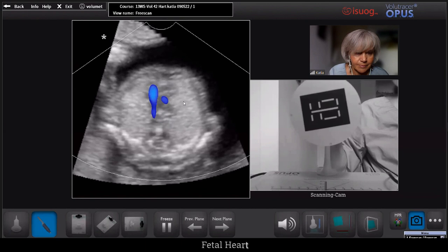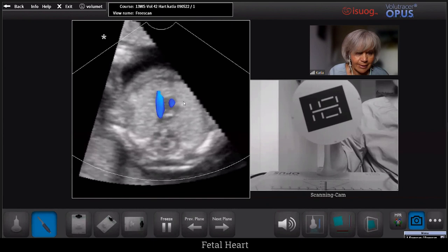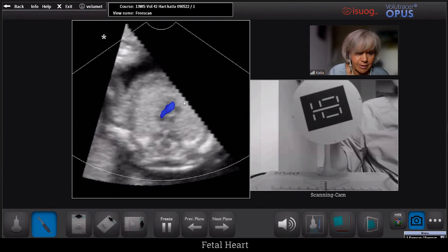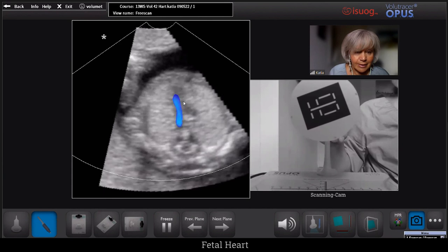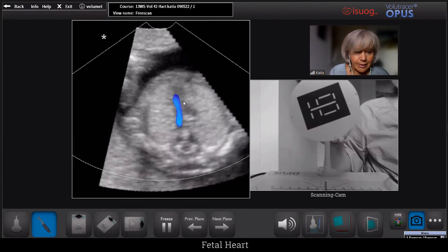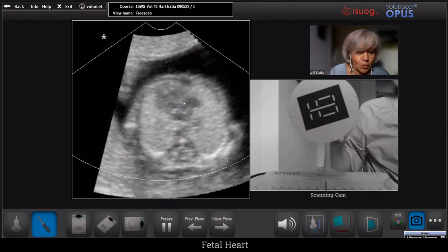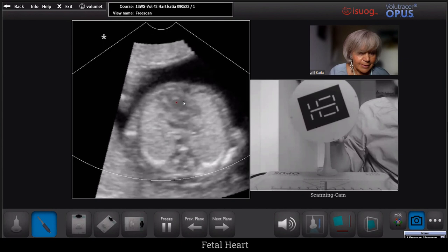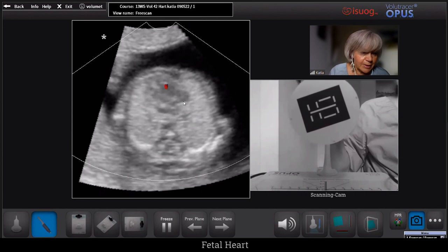Moving higher up, we will see the V sign, with the two outflows meeting towards the spine.